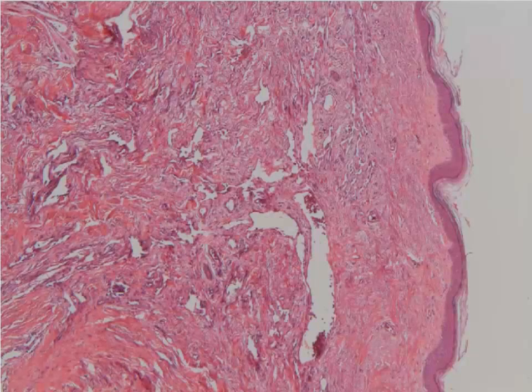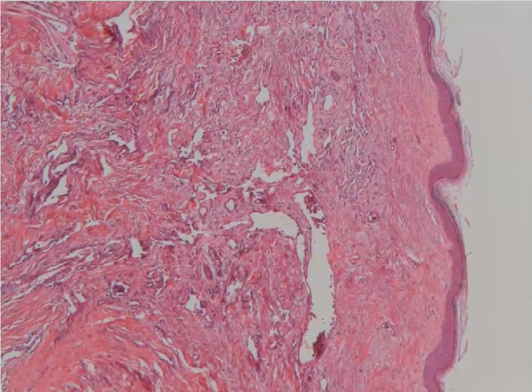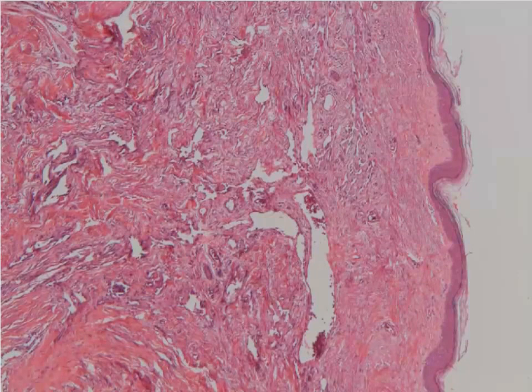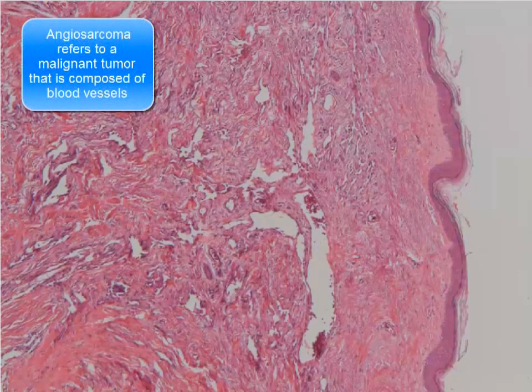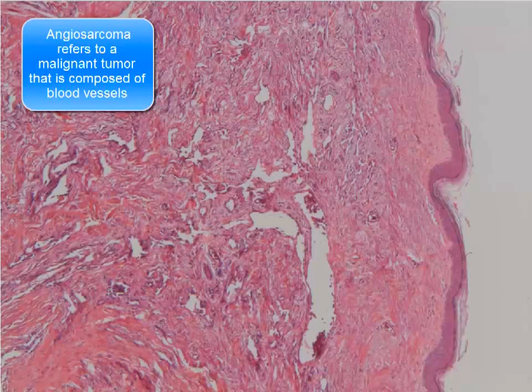Here we're going to be looking at two different examples of angiosarcoma. This first case is going to be an example of a low-grade angiosarcoma, and the second one is going to be more of a high-grade angiosarcoma.